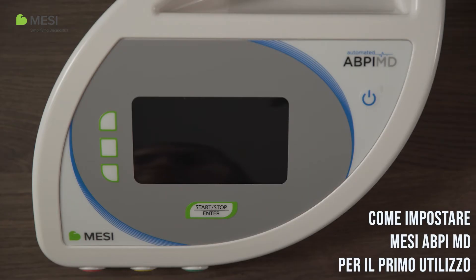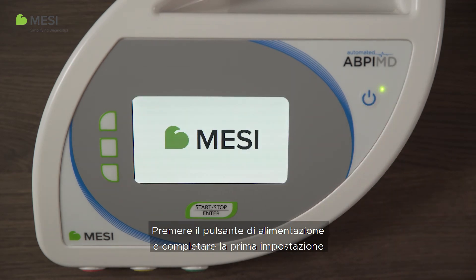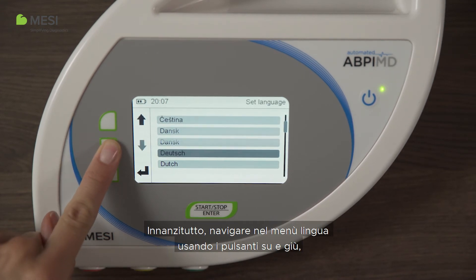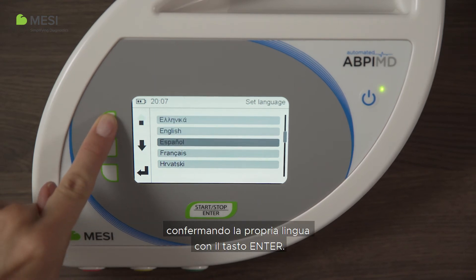How to set up the MESI ABPI-MD for first use. Press the power button and complete first setup. First, navigate through the language menu using the up and down buttons. Confirm your language with the enter button.